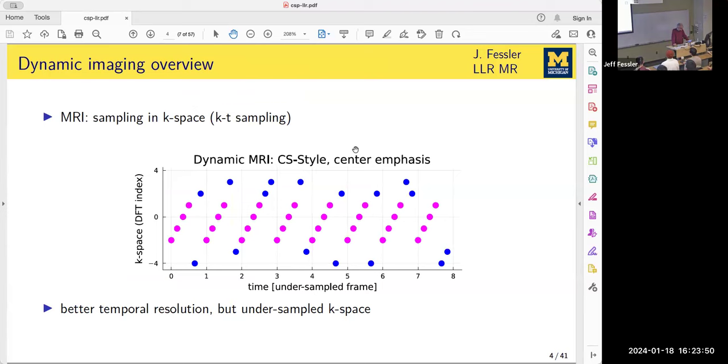So I'll answer it this way. If we put the regularization parameter too large or set the constraint on the rank too small, I think you could end up making two tissues that should be looking different over time, gray matter and white matter, whatever, looking the same. Or maybe instead of gray matter and white matter, normal brain matter and some lesion that for some reason behaves differently over time, you might end up forcing it to fit as a linear combination of the low rank basis that you've ended up with here that makes it look normal. This is absolutely a concern.